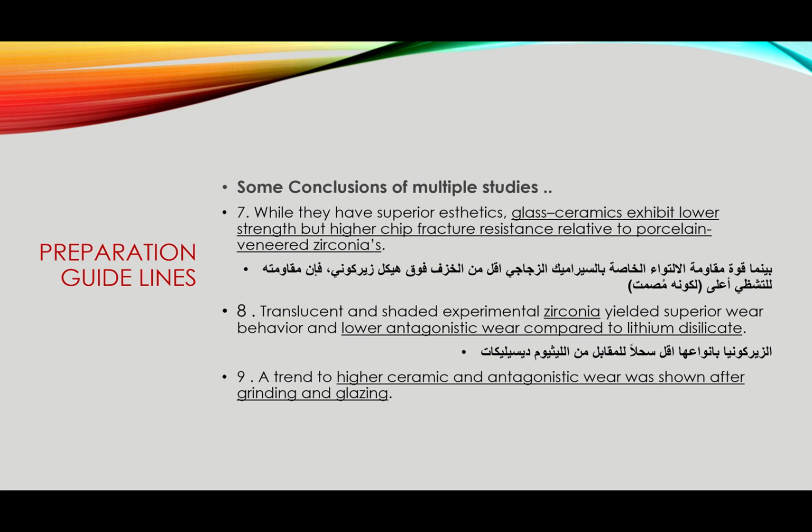As a lab technician, when you get something back for a reglaze, please make sure that you refine that surface. Mostly when a dentist performs selective grinding, you will see that with the tools and the high speed that the dentist uses, the occlusal adjustment is really rough. So make sure that, prior to polishing or glazing, you smooth it very well and then you glaze it. All right, so that's probably why.